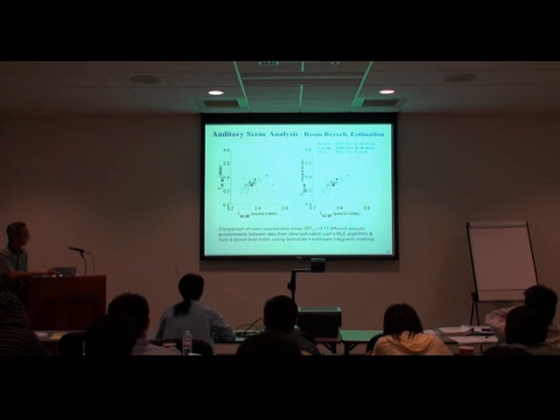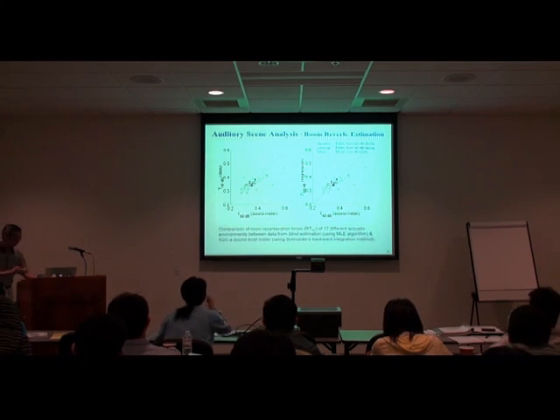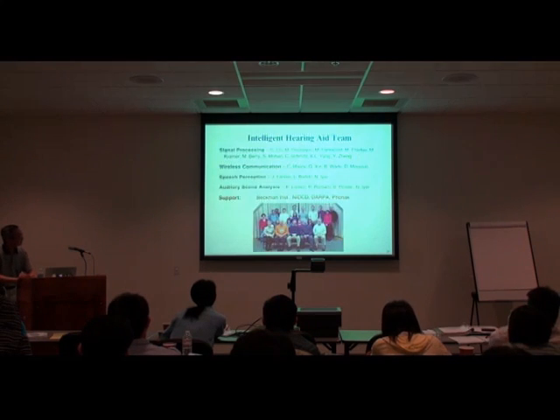We came up with this blind estimation technique so that we can actually assess the reverberation characteristics of the room automatically. Actually, there's a bigger error here than at other points. And so this has been very powerful, and we have the patent also for this technique.